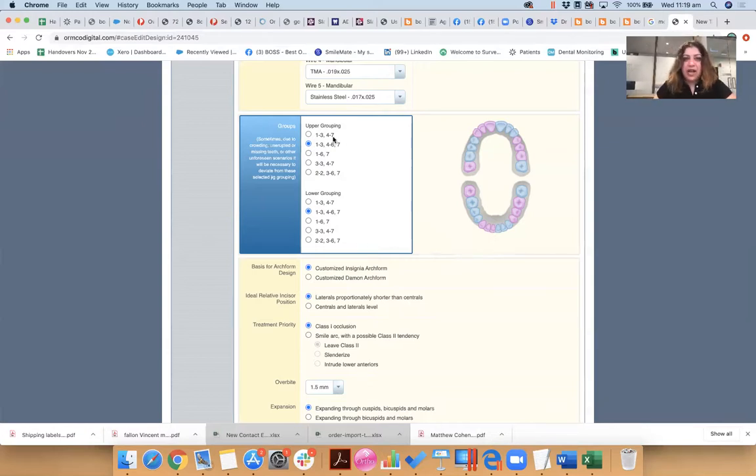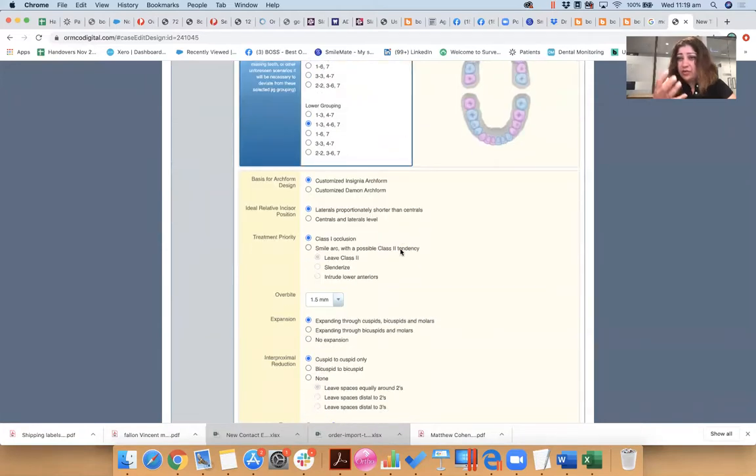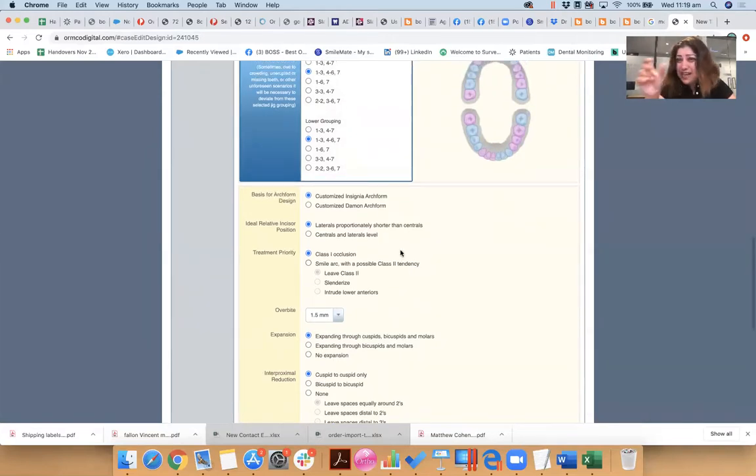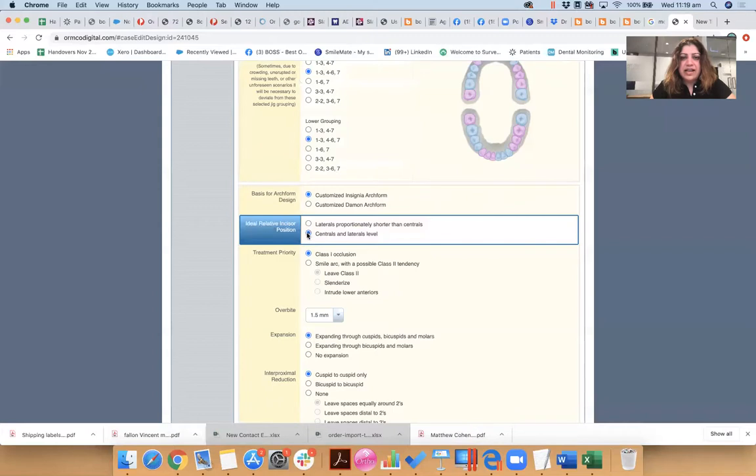Or you might want to go like this, okay? Really, really depends how you like to do your bonding. You get a really cool customized indirect tray in groups like that to bond your brackets in the right position. Now you can choose whether you want your centrals and laterals level or proportionately smaller.